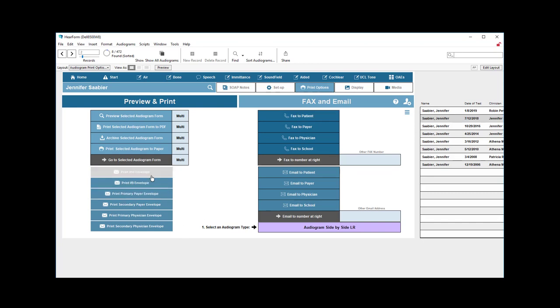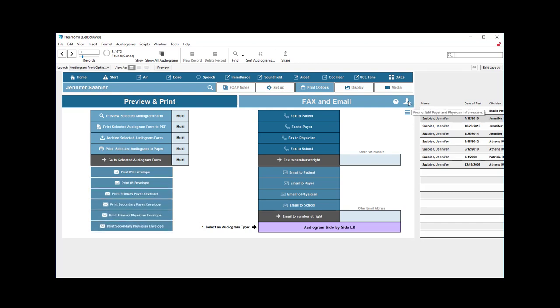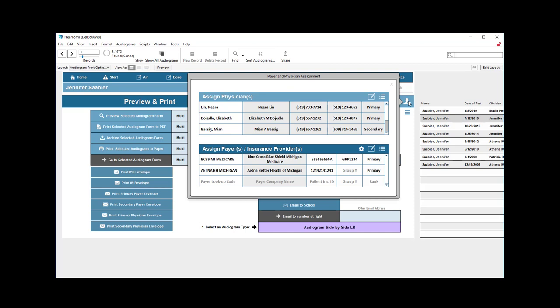For example, you can print a number 10 or number 9 envelope to the patient, to a payer, or to a physician. And over here you can make sure that the physician and the payer is the appropriate one that is assigned to that particular patient.